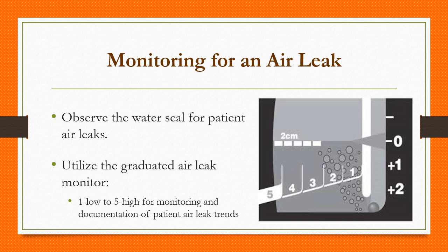Using the graduated air leak monitor, air bubbles create an easy-to-follow air leak pattern for monitoring patient air leak trends, from 1 being a low leak to 5 being high.